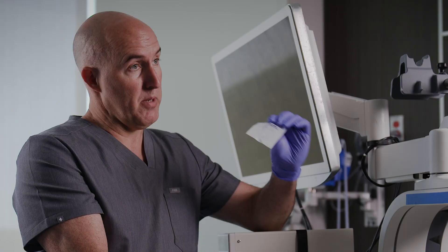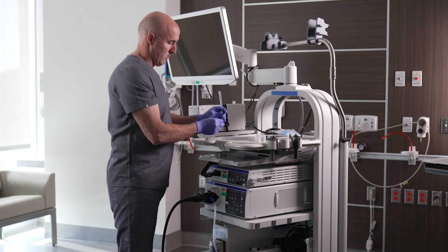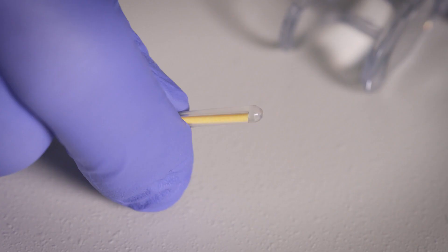ProTrap Luma comes with one tray out of the package, but you can buy all your additional trays as well, so you use as many as you need. The ProTrap Luma also comes with an illumination device — a glow stick.